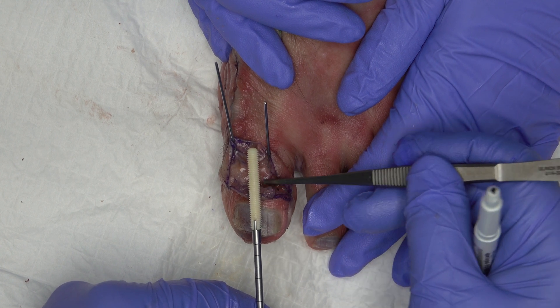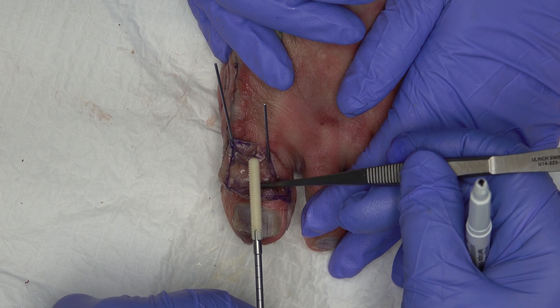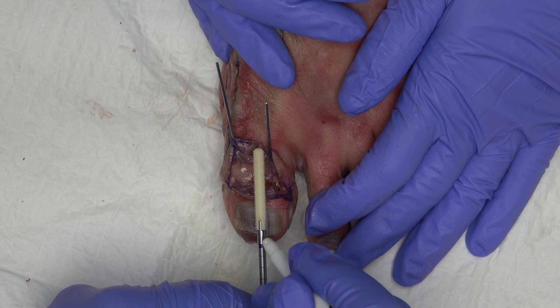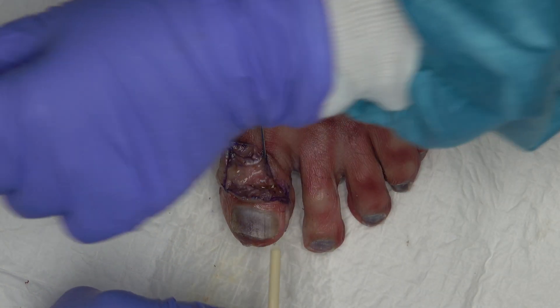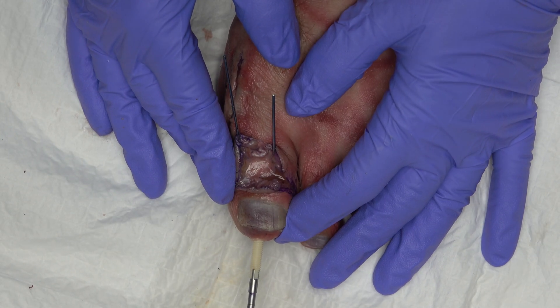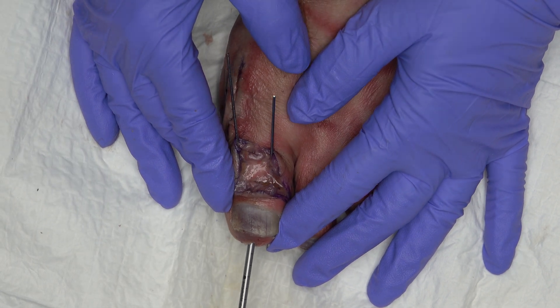In this case, Shark Screw Diver must be countersunk 40 mm from the skin entry point. This means that the screwdriver is marked at the point where insertion must be stopped as soon as it reaches the skin level during insertion. Countersink Shark Screw Diver below the bone surface with intraoperative x-ray control, so that Shark Screw Diver bridges the arthrodesis gap proximally and distally in approximately equal length.